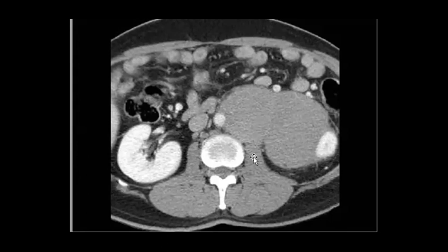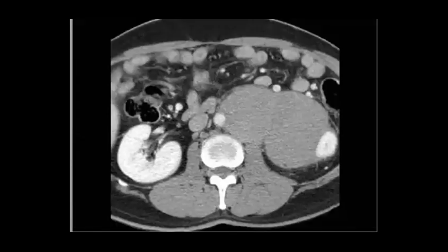So germ cell tumors, you are going to check the testes to see if there is any germ cell tumor such as seminoma. This is a very common scenario that you should know. When you find this, you will put other differential diagnoses like lymphoma and so on, but don't forget germ cell tumors. Seminoma, embryonal cell carcinoma, which is more aggressive, and choriocarcinoma, and teratomas. And also the sex cord tumors as well, like Leydig and Sertoli cell tumor. Okay.